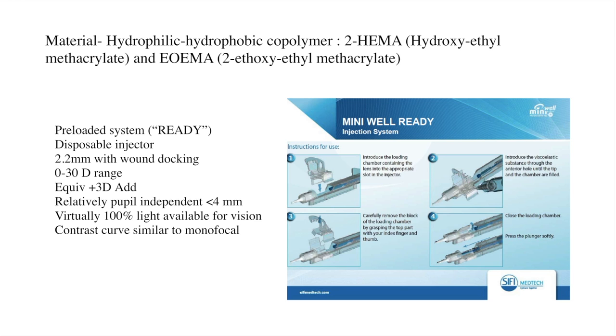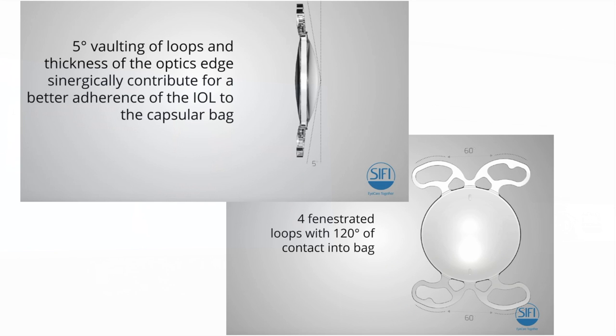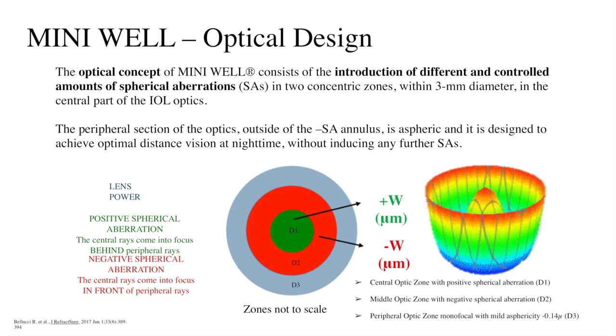The vision that you get through this is relatively pupil independent, up to a pupil size of about 4 millimeters. Virtually all the light that you have is available for vision, and the contrast curve is very similar to a monofocal. It has a 5-degree angulation to the haptics, and it has four looped haptics, giving a contact area of 120 degrees with the capsular bag.